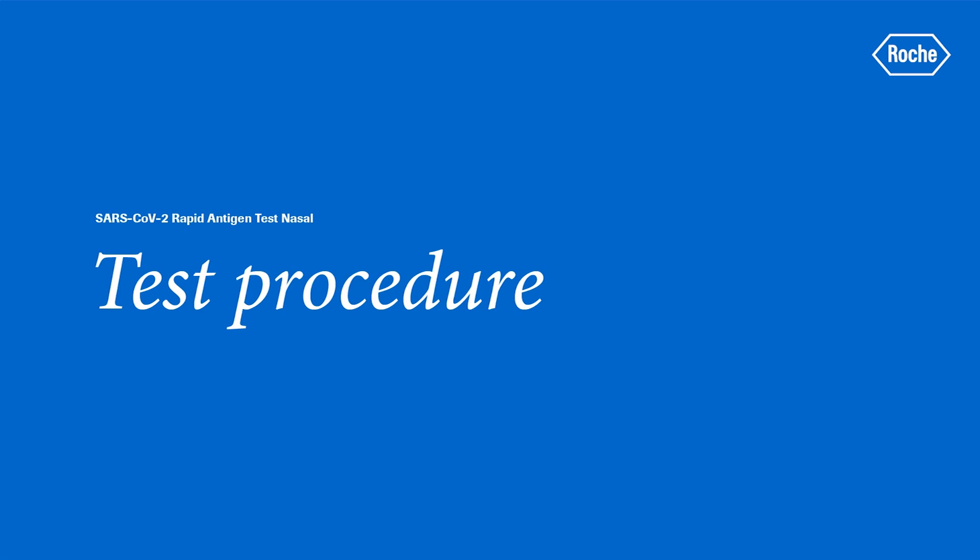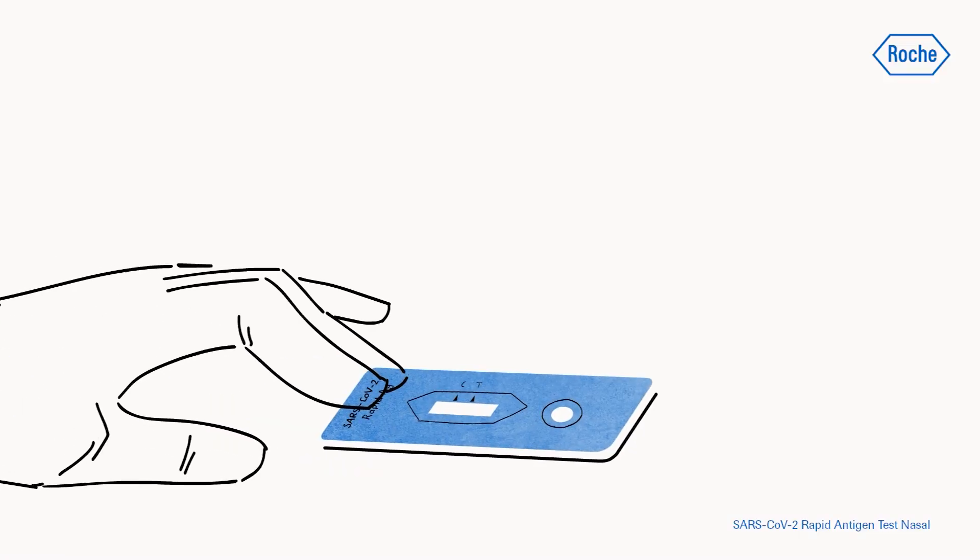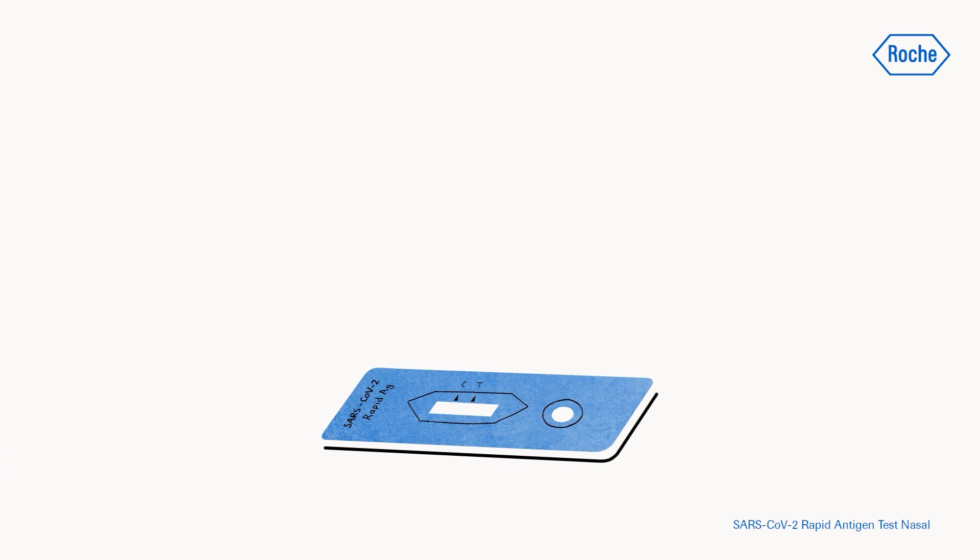Here's how to proceed with the sample. Place the test device on a flat surface. Turn the tube and apply four drops of extracted sample at a 90 degree angle to the specimen well of the test device.